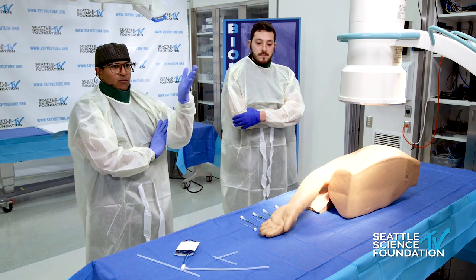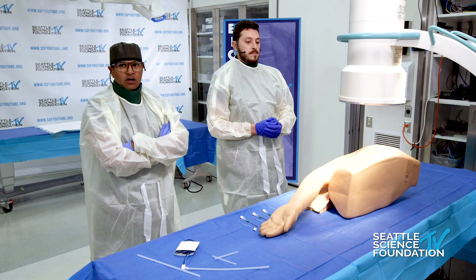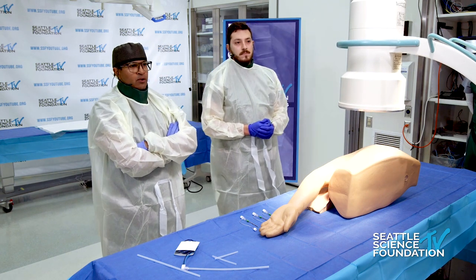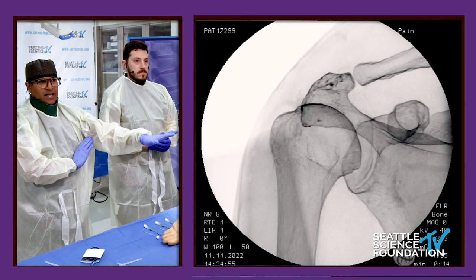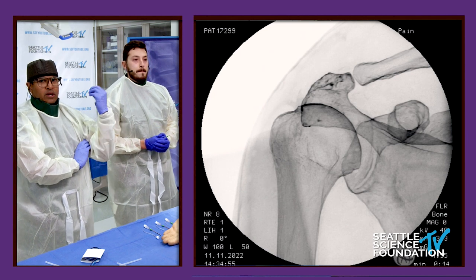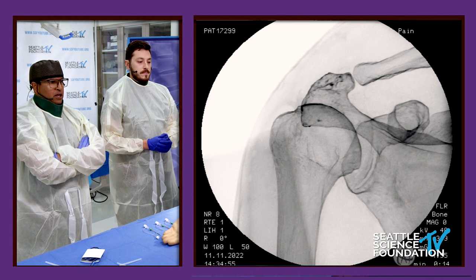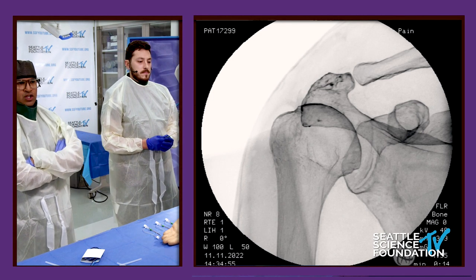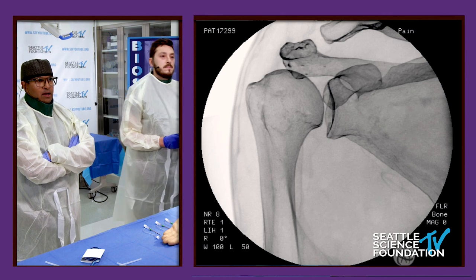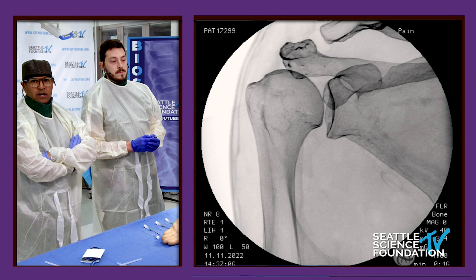So let's get started. We've got our view here. We're using a synthetic model. There's a specific view called a Grashey view, G-R-A-S-H-E-Y, to flatten out the glenoid and have an excellent view on the humeral head here. So what we're seeing here is a direct AP view on the table. What Steve's going to do is oblique 20 degrees towards me on the C-arm, and bring a caudal tilt about 15 degrees. This is the Grashey view, which shoulder surgeons are certainly familiar with. What you're seeing here is that the glenoid fossa basically flattens, and that's a very nice view.